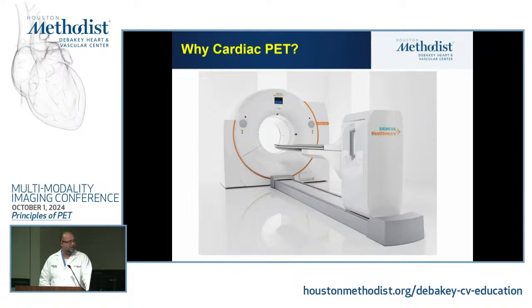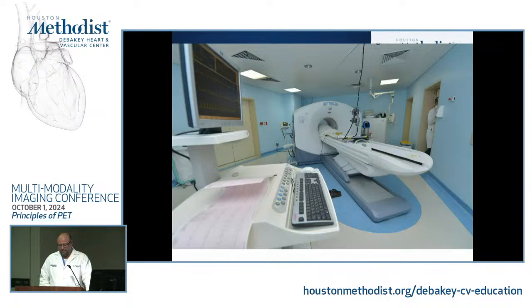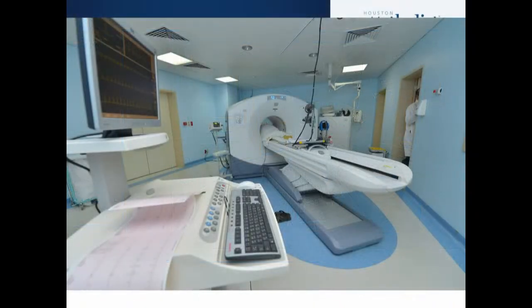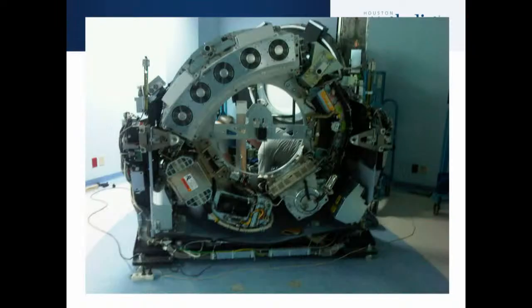First of all, the anatomy of the machine. This is a machine that we have in our research institute, but we also have in the outpatient center. This is another PET system from another vendor, so all of them technically from outside look the same. If you start to take out all these nice covers, this is how the system looks from inside.